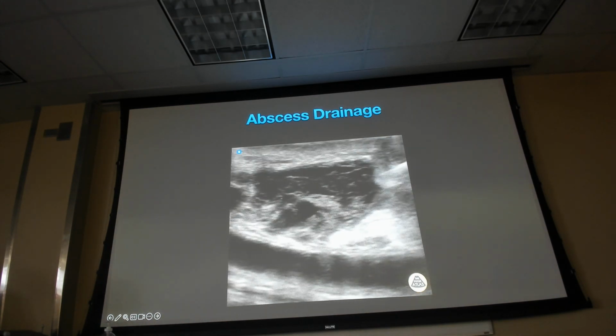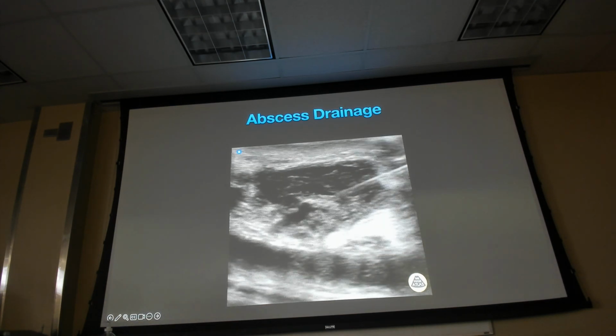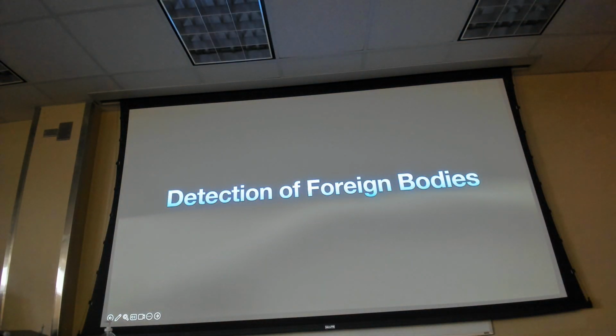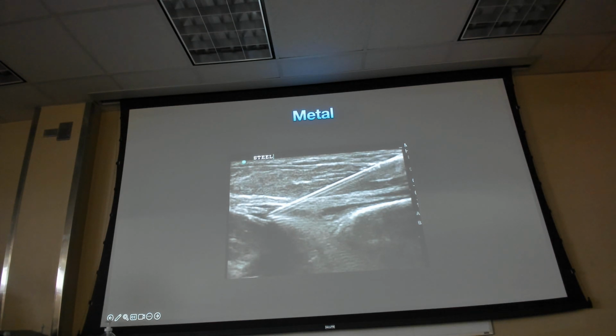Then I can also tell after I've I&D'd something, did I get all of it out? Are all the loculations out? Okay, so they have less recurrence. So it's a really good thing for you to use. And trust me, downrange, there's lots of abscesses, okay? Bad hygiene, bunch of bad conditions. I mean, it happens.